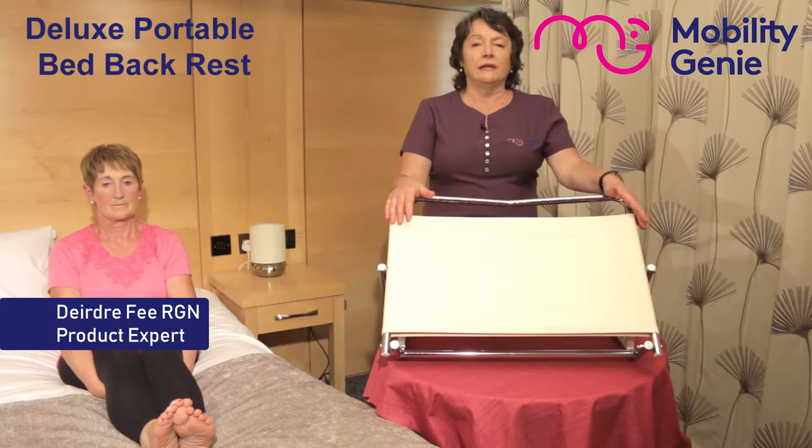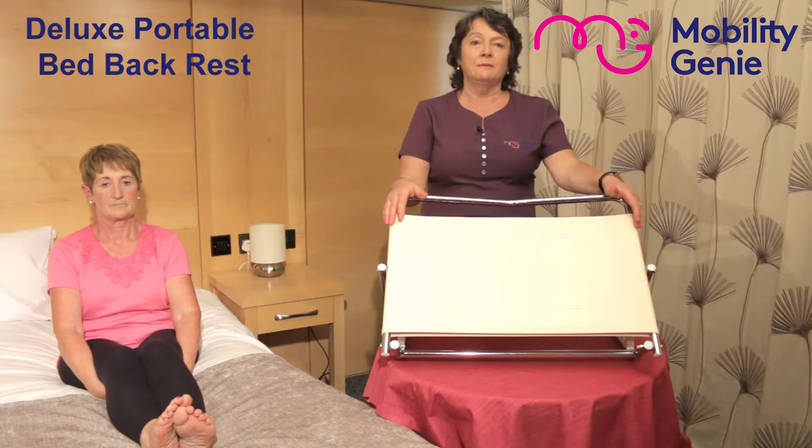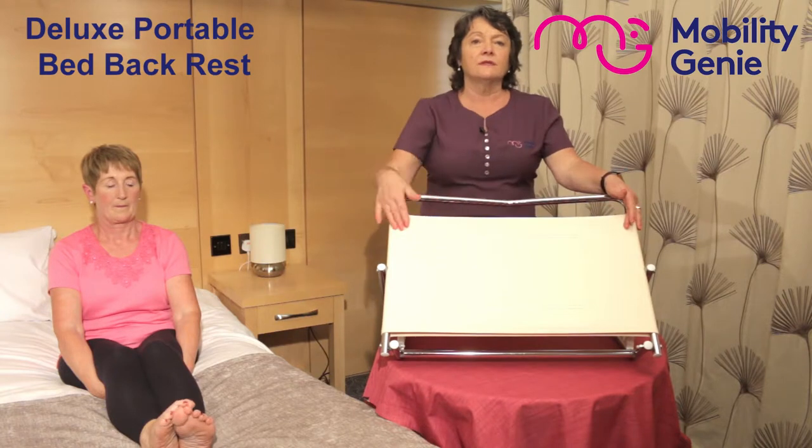I'm Deirdre from Mobility Genie. At Mobility Genie, we recommend the Deluxe Portable Bed Backrest. It's chrome-plated steel, complete with a white soft vinyl back.